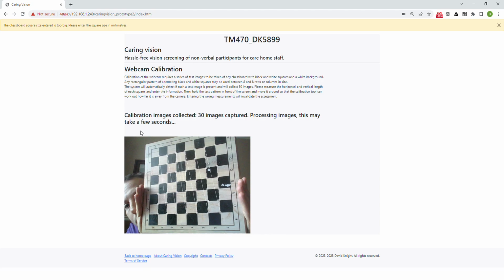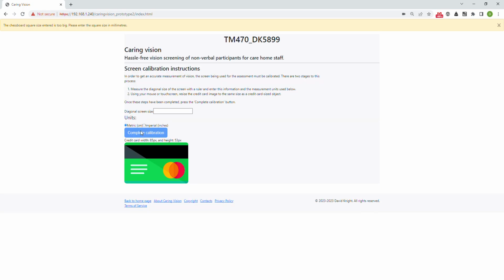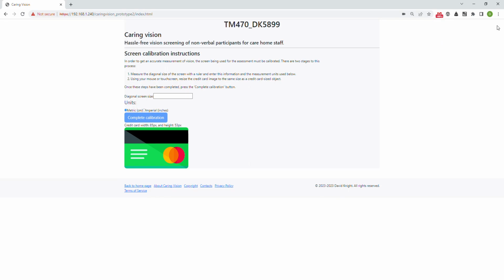it's processing. Of course, how long it takes to process will depend on the speed of the computer. This is all being done on the actual computer that you're using. Nothing is being sent to the server. So it's done that, and it's obviously passed. If it hadn't, it would have brought up an error message telling me that the calibration was inaccurate, but obviously I was happy with that calibration.